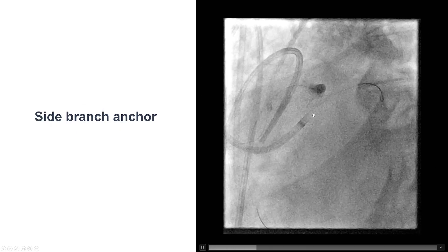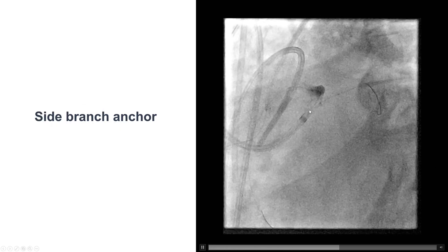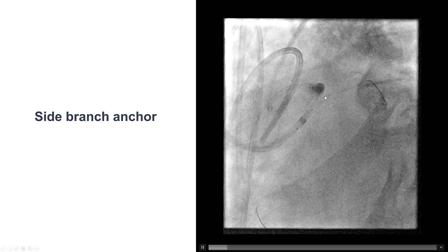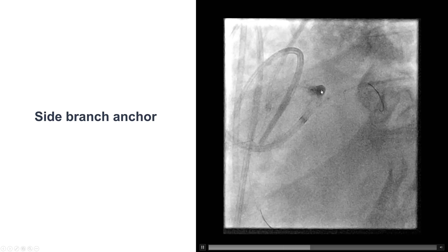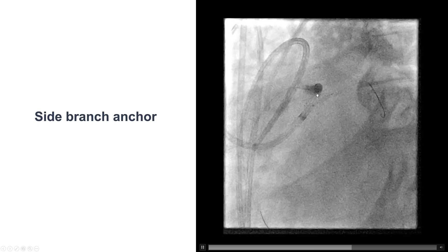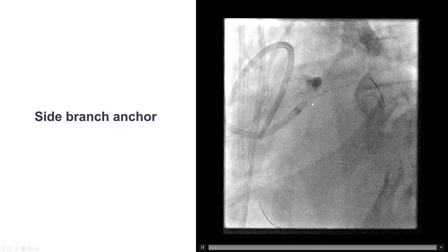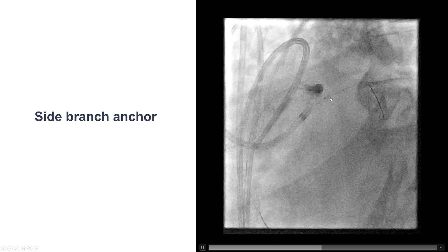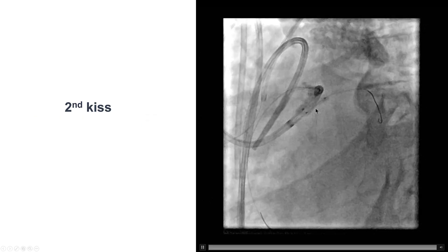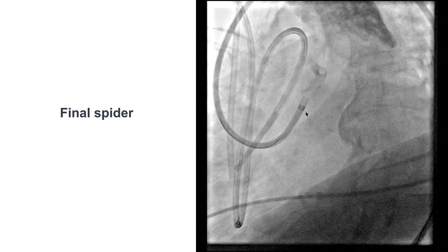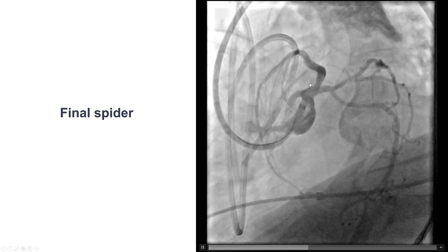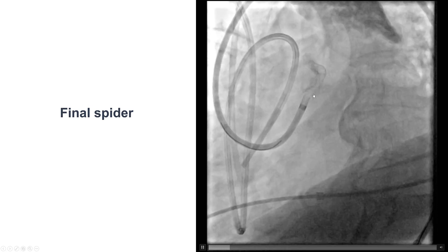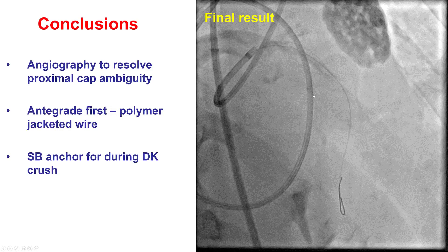We advanced a guidewire into the circumflex. We had difficulty delivering a balloon to the circumflex, but by using the side branch anchoring technique — inflating a balloon into the LAD — we were able to easily advance a balloon into the circumflex. We performed the second kissing balloon inflation, and this was the final result, which was excellent as confirmed by intravascular ultrasound.